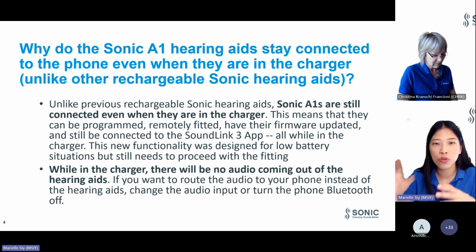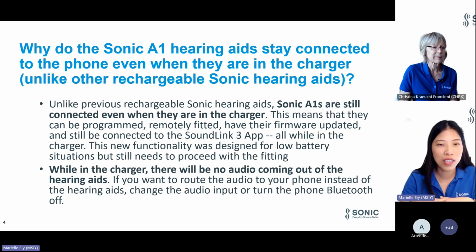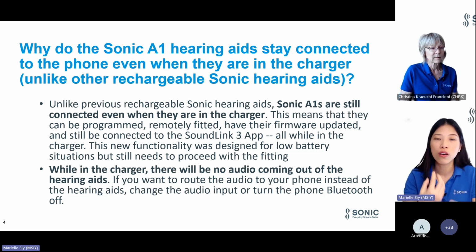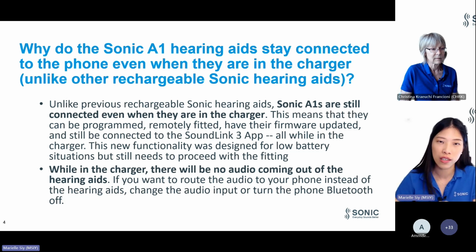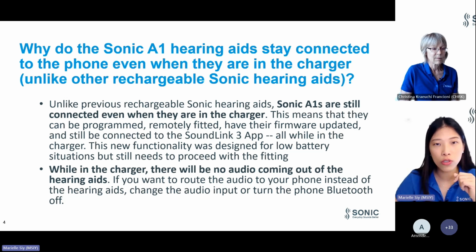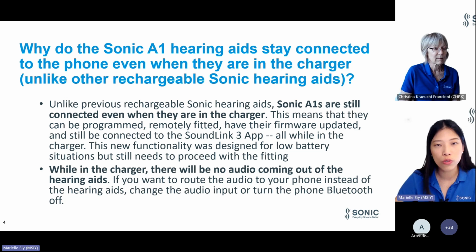So if you want to move the audio back to your phone, as Christina has suggested, just change the audio input, or you can turn the Bluetooth of the phone off. So the sound will come out of your phone instead of the hearing aid in the charger. So this is something to be aware of. That also includes phone calls. So if you're charging your hearing aid and you're expecting an important phone call, turn the phone Bluetooth off so you can hear it from your phone.